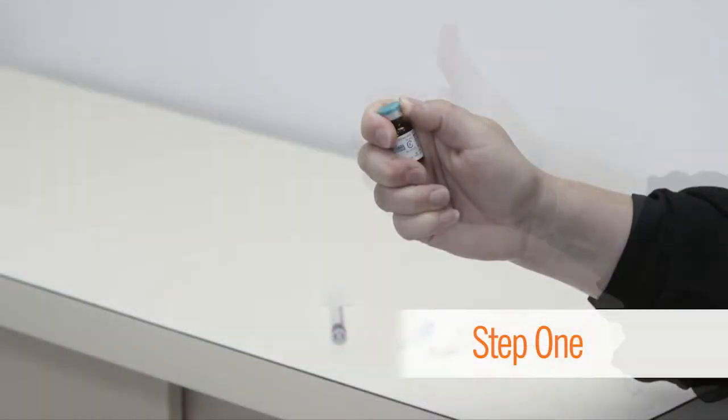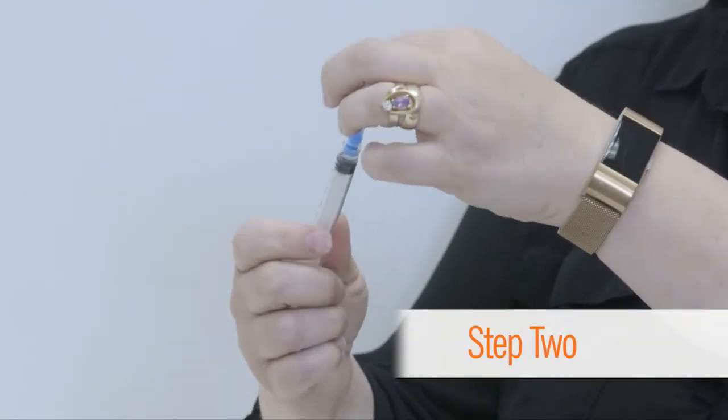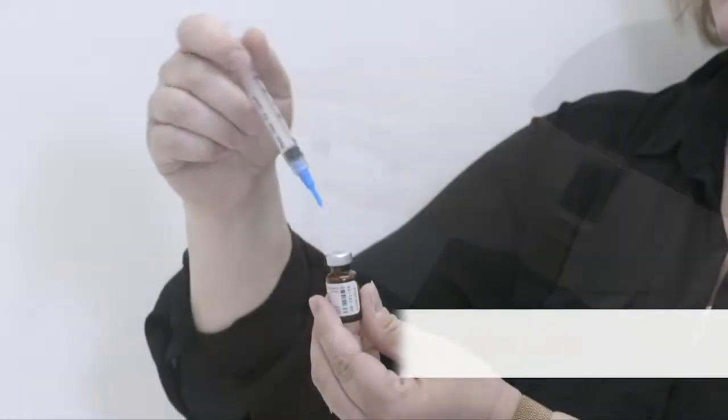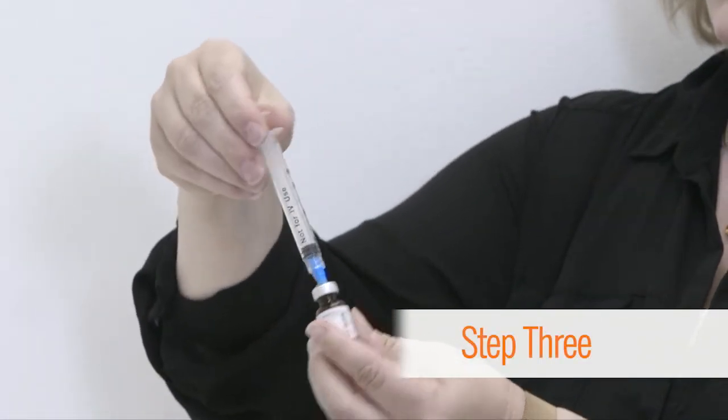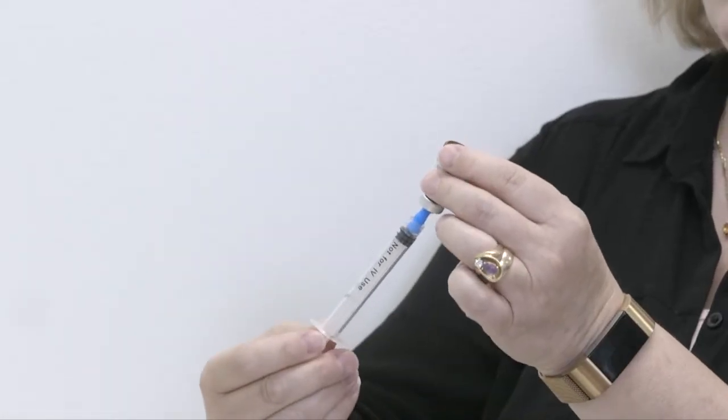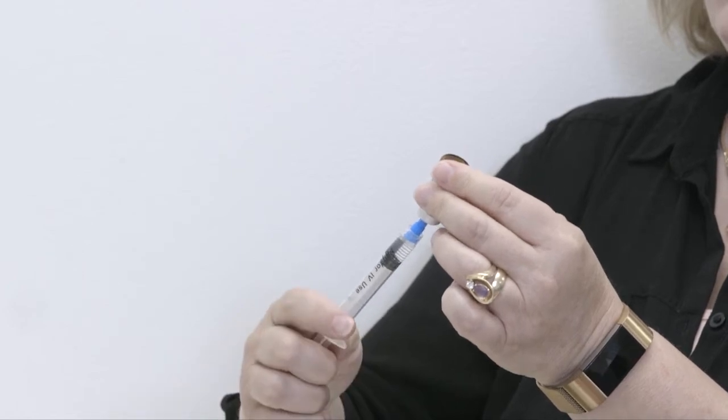Take the cap off the medication vial. Place a blunt tip needle on the syringe. Insert the needle into the medication vial and turn it upside down. Pull back on the syringe and get all of the medication out of the vial and into the syringe.